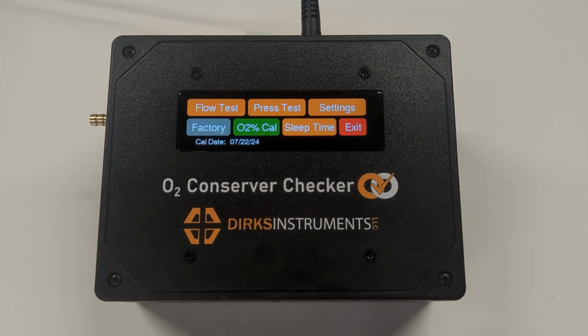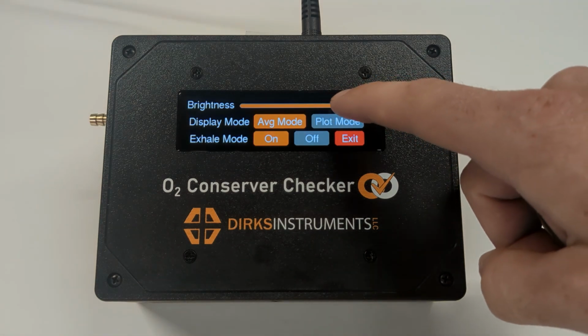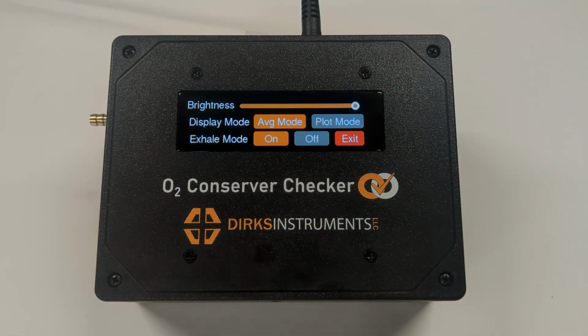If we go to the Settings menu, we have three different parameters we can adjust. We have a screen brightness that can be adjusted. This setting will be stored in memory, so when you reset the device, it will always come on at that brightness. Then we have our display mode.